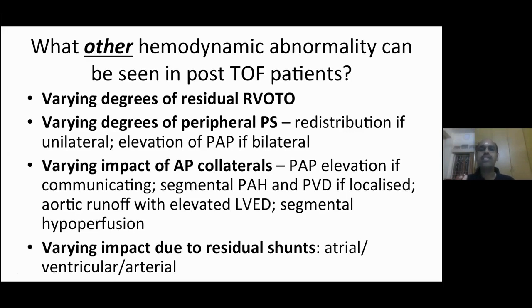And if there is a luminal narrowing of significance in angiographic or anatomical imaging like a CT scan, that is significant. Pulmonary artery gradients are not given any significance in unilateral pulmonary artery stenosis. Only it works in bilateral peripheral pulmonary artery stenosis.